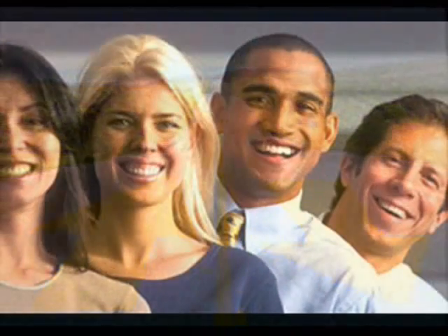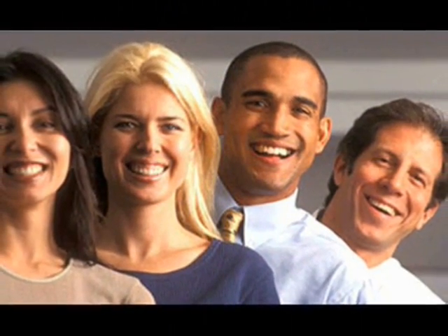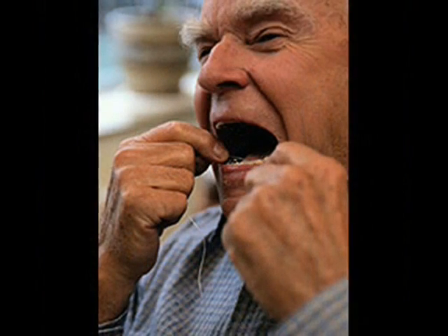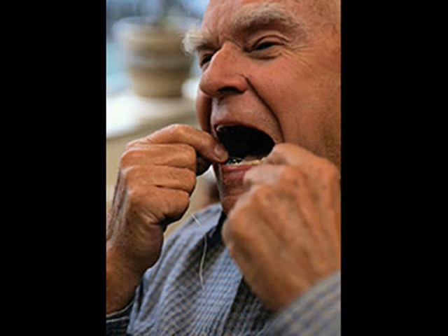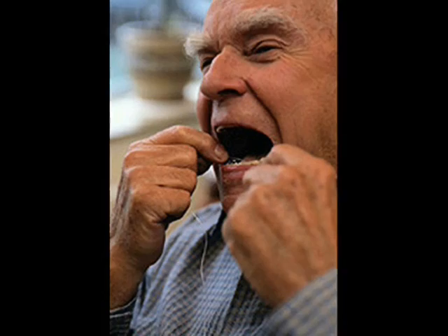Successful orthodontic treatment is a two-way street that requires a constant cooperative effort by both the orthodontist and the patient. To successfully complete the treatment plan, the patient must correctly use the orthodontic appliances to deliver forces in a very specific manner. If the appliance is not worn as requested, the treatment will not proceed as planned. Maintain proper oral hygiene by brushing, flossing, and fluoride mouth rinses. Take care of the appliances. Lost, broken, or bent appliances can lengthen the treatment time, as unwanted tooth movement may occur if the appliance is not working.